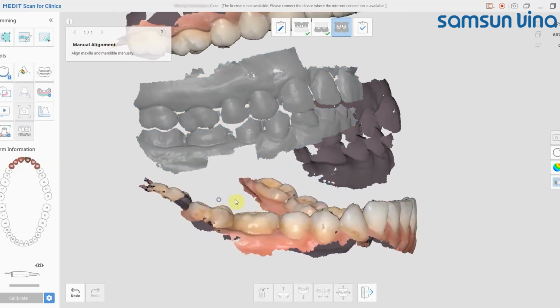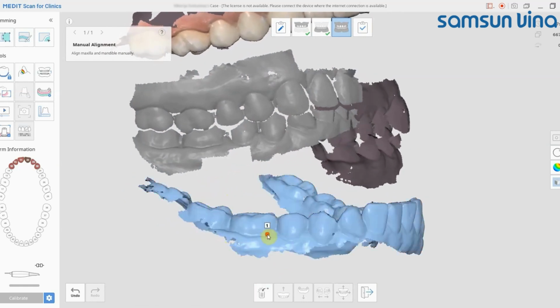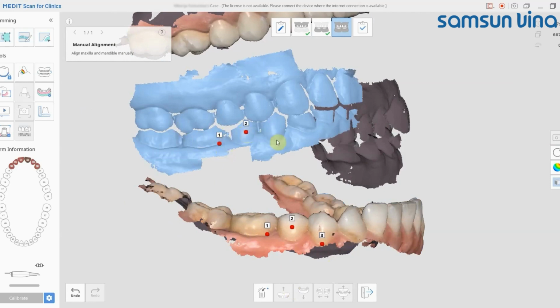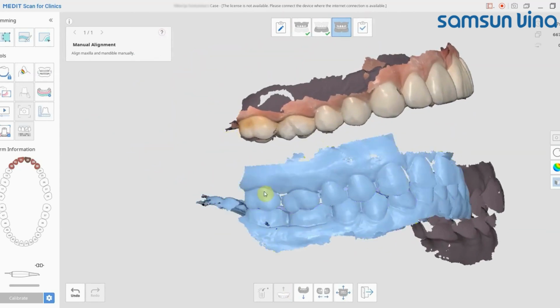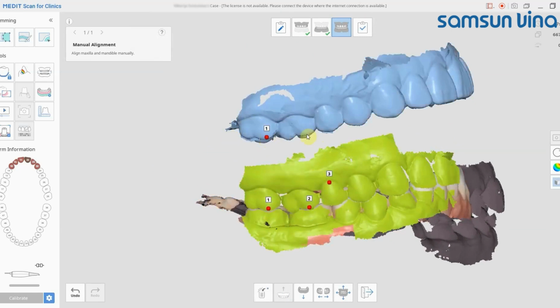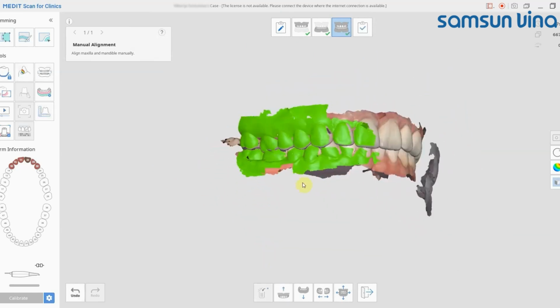So let's have a look. We'll put 1 point here. We'll put a point in the middle of this tooth, and we'll put a point down here. Okay, so we're just going to click roughly in the same positions on the bite scan, and the computer will then work out exactly where it needs to be. You're just giving it a rough idea, and we'll now do the same for the upper. So let's go here, here, and here. Given it a rough idea, and now it's put it into the right position.